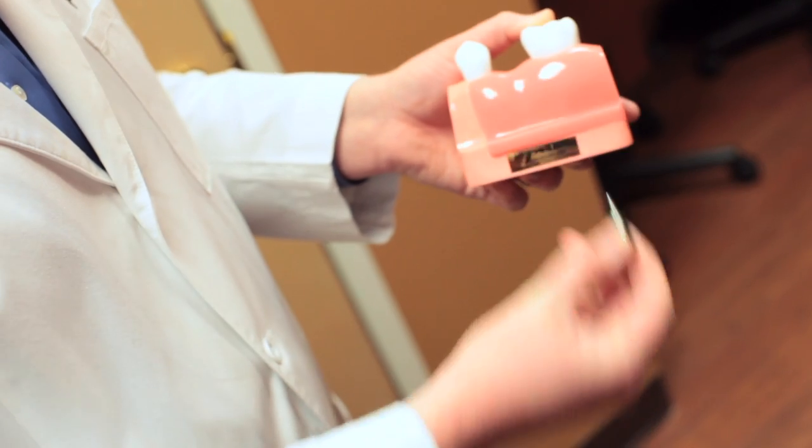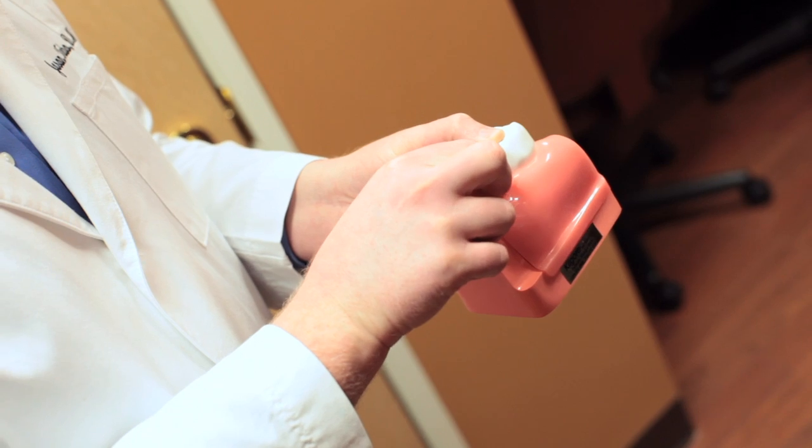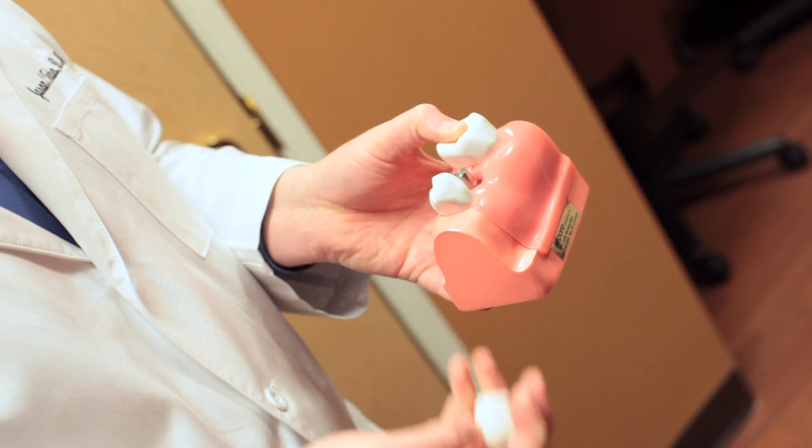The dental implant is placed and we allow it to heal for a period of about four months on average. After four months we can add what's called the abutment post. The abutment post connects into the implant, and everything from here on out is a lot like connecting Legos to Legos — it's very simple, it's absolutely painless, and we don't have to get you numb anymore after the surgical process. The abutment connects to the implant, stands up through the gum, and gives us something to hold on to.